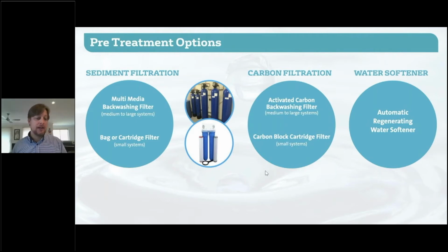In a lot of sites, there is a softener at the point of entrance to the hospital to soften the water for the whole site. So a softener may already be in place, or in some cases, like in parts of Victoria or the Sunshine Coast up here, where you have lovely soft water from the council, it may not be required.